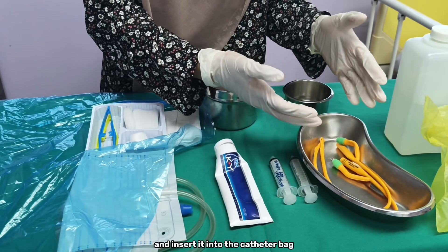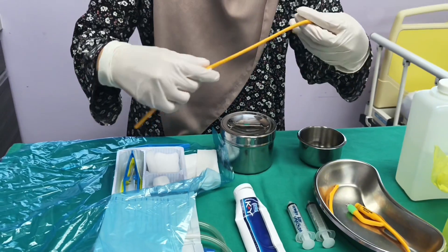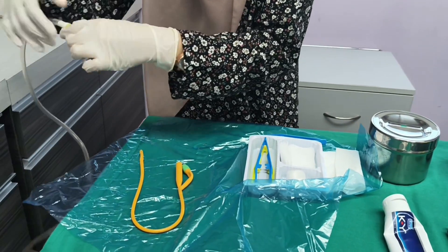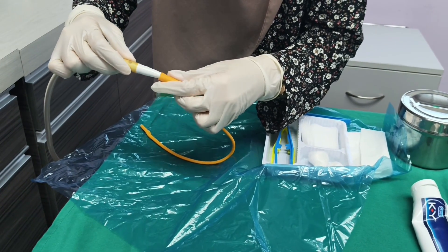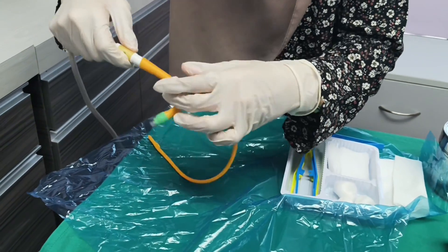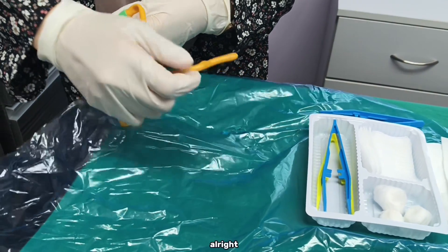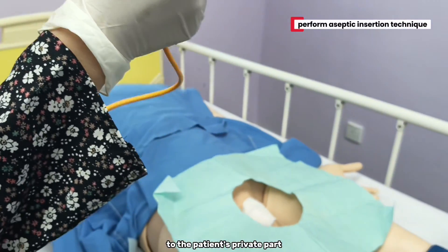Now I'm going to prepare the catheter and connect it to the catheter bag. I'm going to dip the catheter into the lubricant gel. Next, I'm going to insert it into the patient's urethral opening.